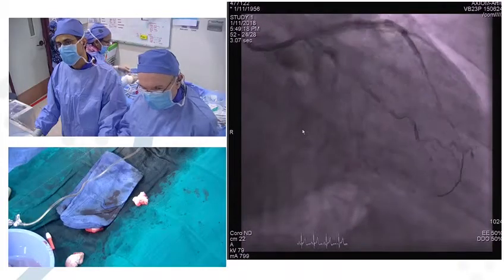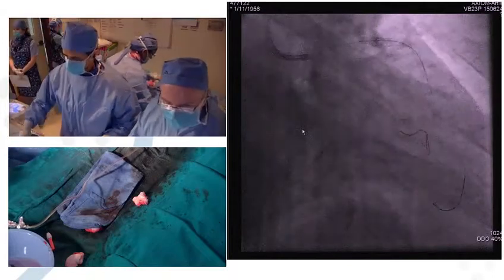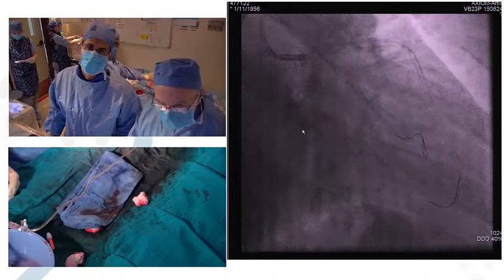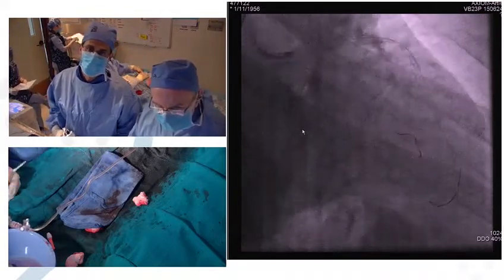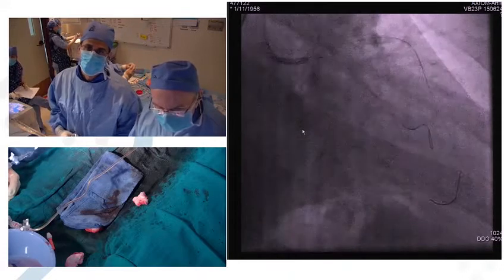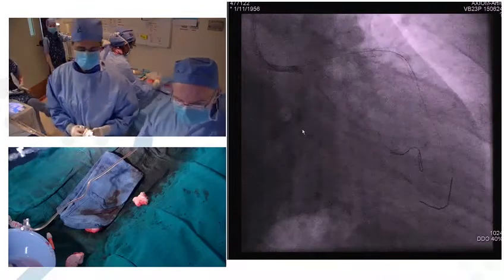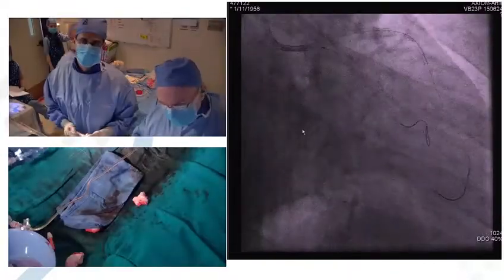We have rewired with a Pilot. I just try where the balloon goes easily, but maybe I have hit the wrong struts, but there's also a way where you can overdo it. Yeah, it went through. Okay. So now we do kissing. Go up. Okay, go up.